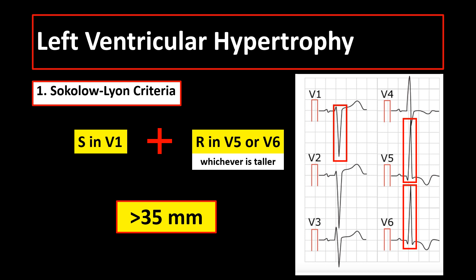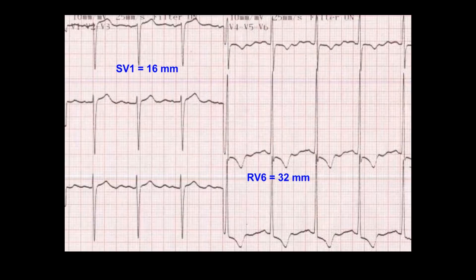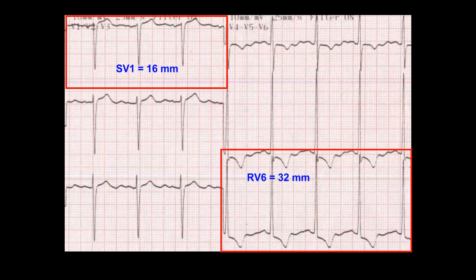For example, in this case, the S or negative deflection in V1 is 16 millimeters, while the R or positive deflection in V6 is 32 millimeters, with a total of 48 millimeters. So this is left ventricular hypertrophy by Sokolow-Lyon criteria.